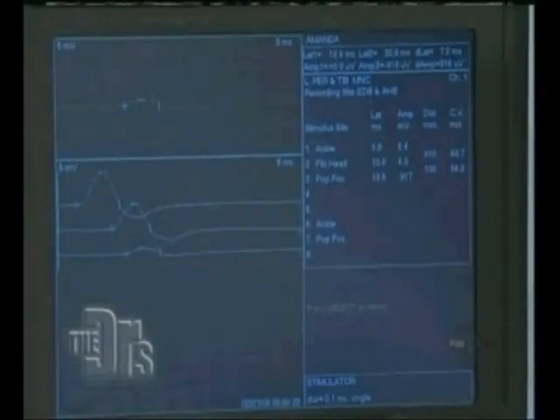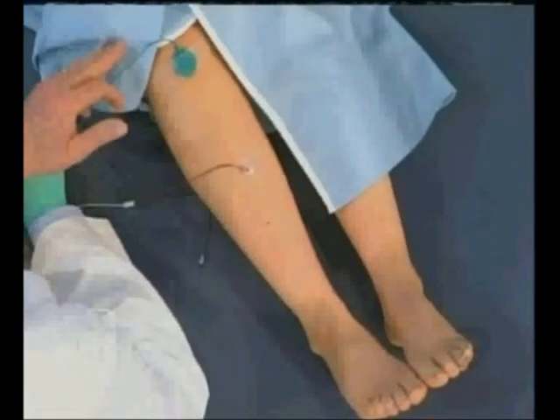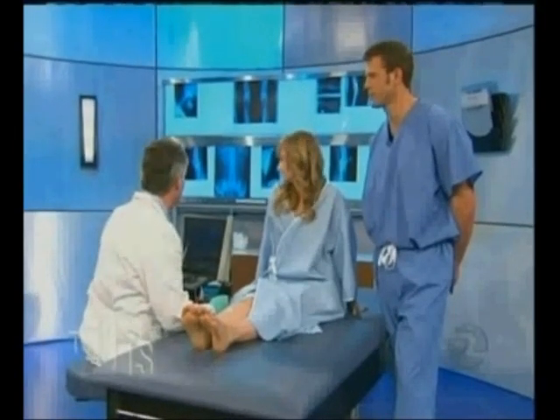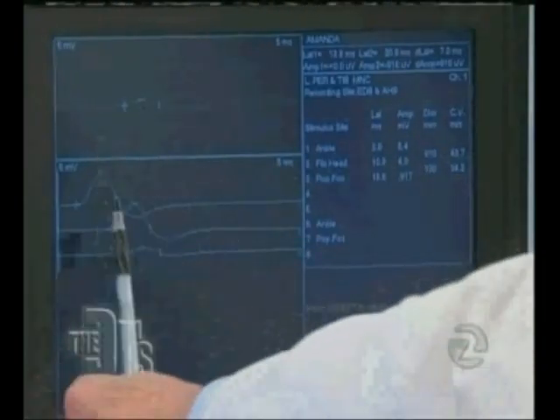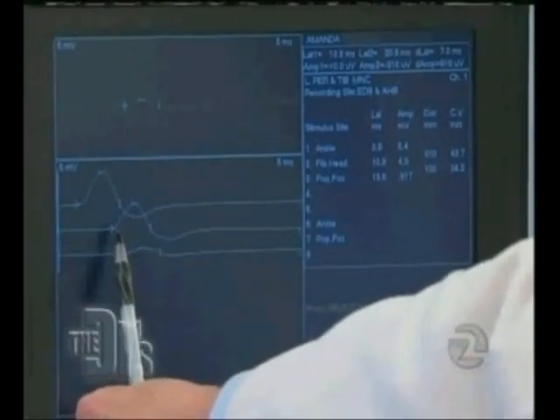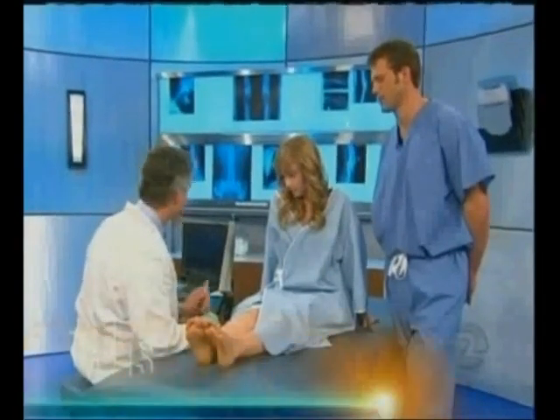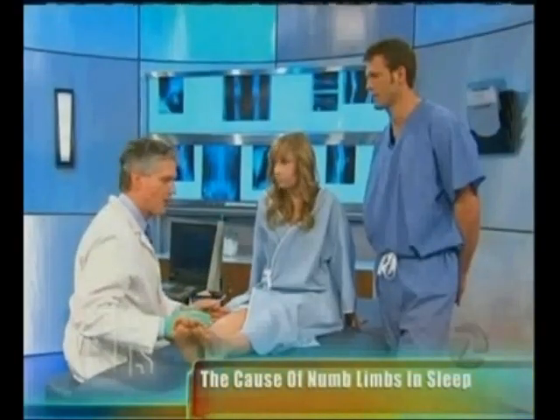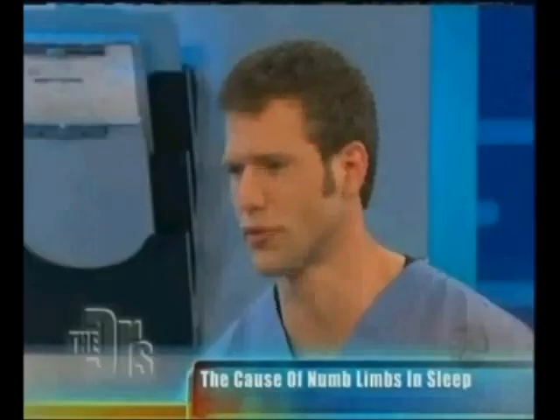I stimulated first at the ankle, then below the area where she has the problem, and then above the area where she has the problem. The first waveform at the ankle looks fine — normal. The second one below the knee looks very much like it and is normal as well. It isn't until I get across the area where the problem lies that we see the waveform is much smaller — it drops from 44 below to 33 above. It should be faster higher up, so there's an obvious drop.